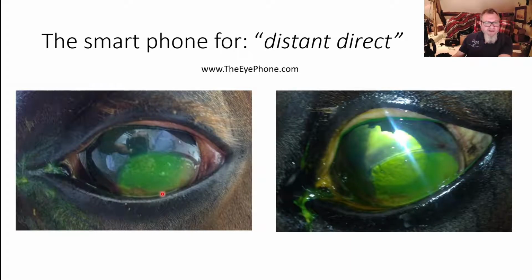The next patient has had a superficial keratectomy. Again with the light off, we can see the dorsal cornea is normal. You can see the reflection of the phone and myself and my colleagues, my hand. You can see the computer screen in the background, but as we get to the bottom half of the cornea, those corneal reflections are completely disrupted. This is where the anterior cornea has been removed with superficial keratectomy.